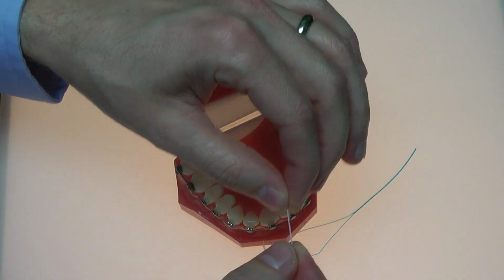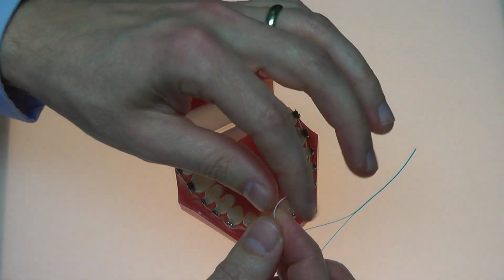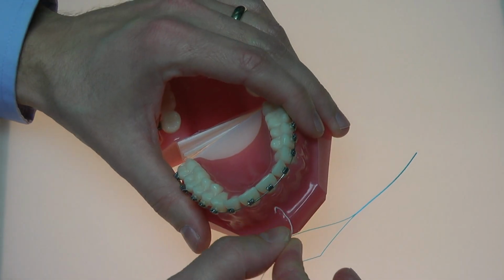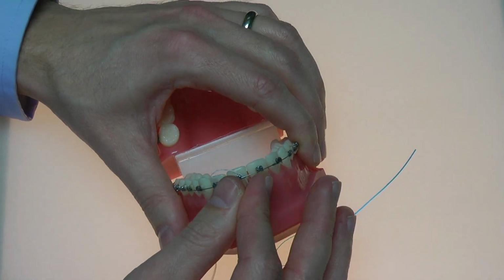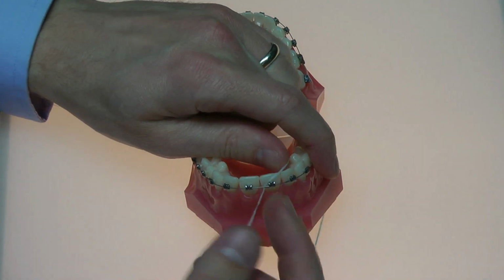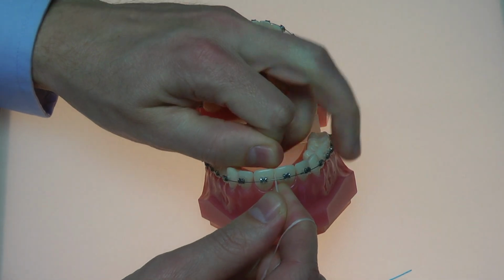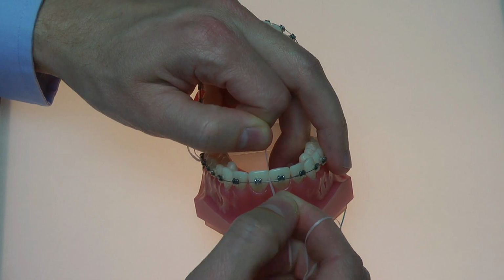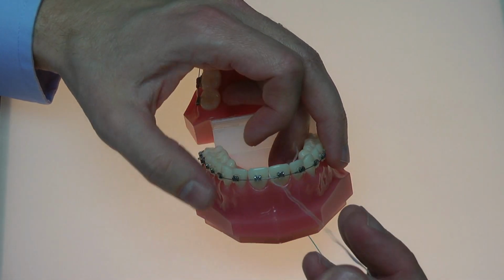You can just use the loose end of a piece of floss. The stiffer the floss, the easier it is to hold it and put it underneath the wire. But if you're skilled, you can put it underneath the wire without a floss threader and then just hold both ends as we've shown before, and break the contact by sawing back and forth. Once you get below the contact, rub up and down on one tooth, up and down the other tooth, and then pull it out from underneath.